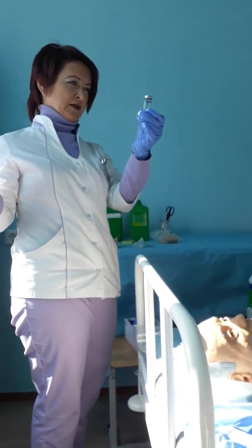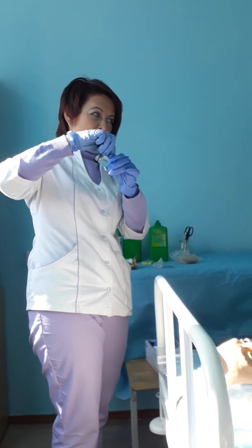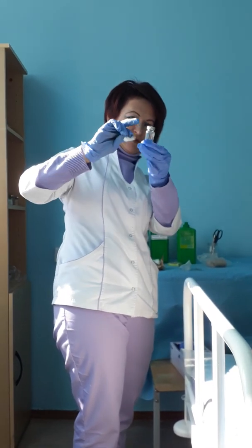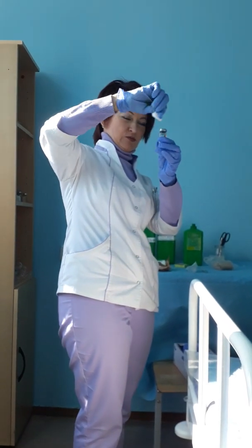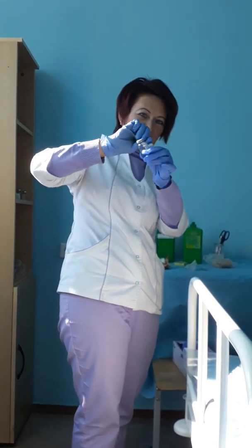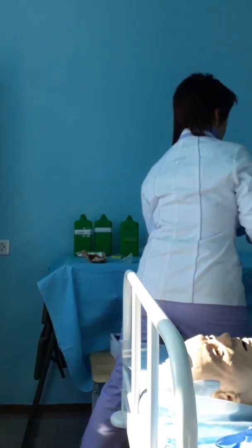What part of the vial must I clean? Not the top; covering the upper third. Or it doesn't matter, small vial or biggest vial? Every time, first you clean the upper third, one third of the vial.